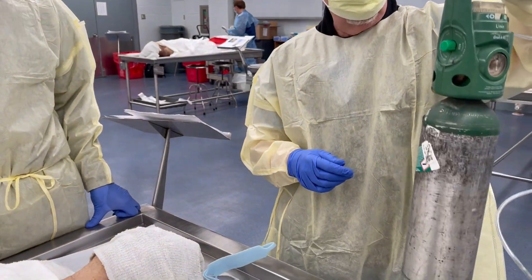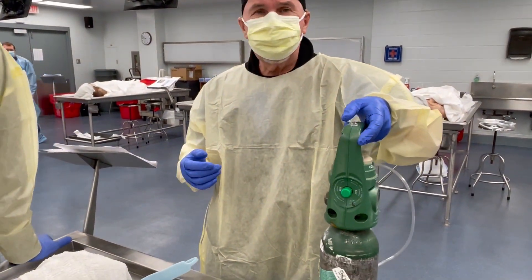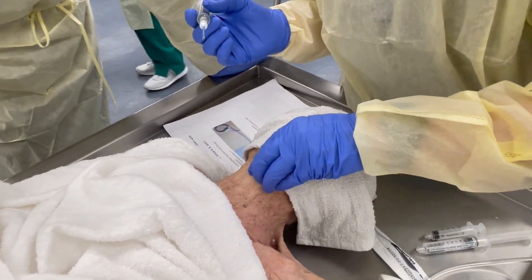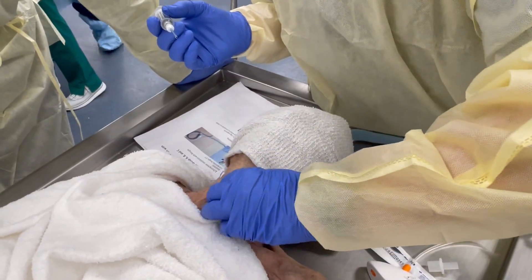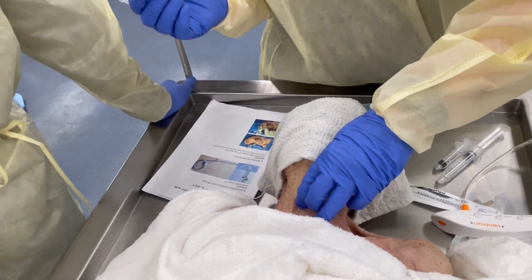I also have oxygen, and we'll crank it up to about 15 liters, and we'll see if we can bail it, okay? I'm going to find the cricothyroid membrane — so I think here's my larynx, and I have to assume it's right about here.